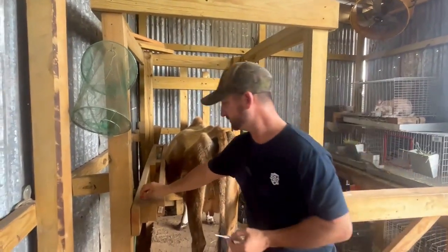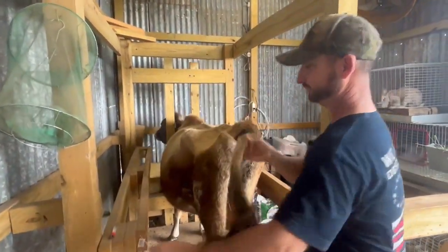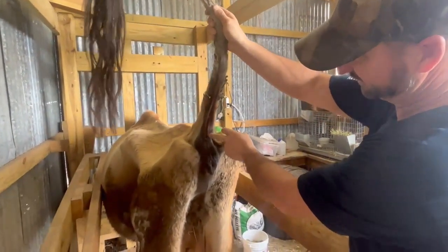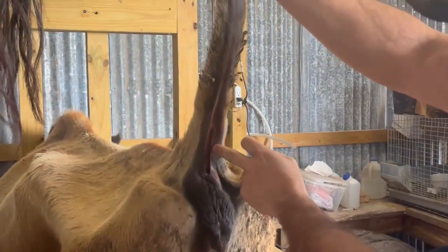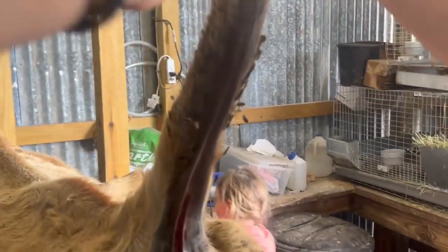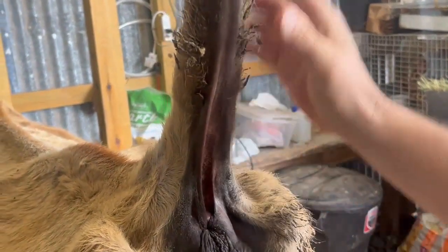First thing you do is make sure she's clean underneath the tail right here. We're going to go ahead and insert the needle right next to this kind of V shape in the tail — there's a vein right there we want to draw blood from. So that is what I'm going to do right now. Can you hold the tail? All right, here we go.